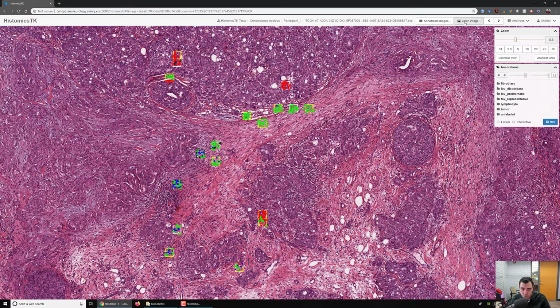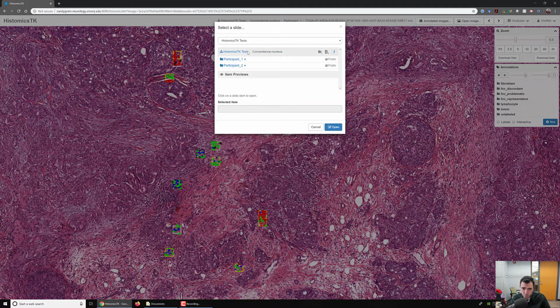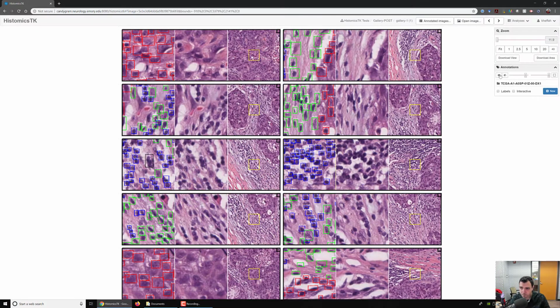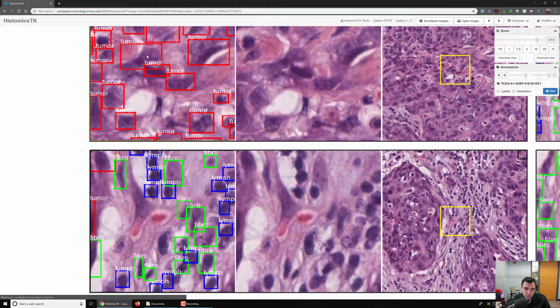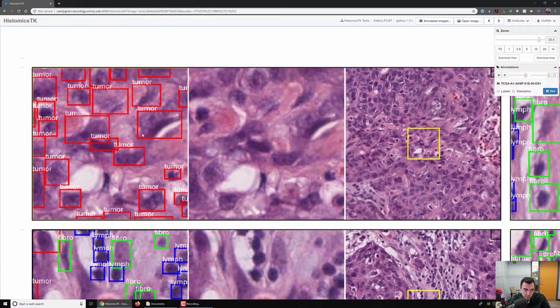So after running the code that is in the annotation gallery feature, we end up with something that looks like this, which is basically everything in the folder that we took a look at in these 2 slides tiled into this array. And if we open one of these and we make sure we view the annotations like this, you will see that what this shows is an image with the annotations on, including labels that are automatically displayed for very quick bird's eye view.